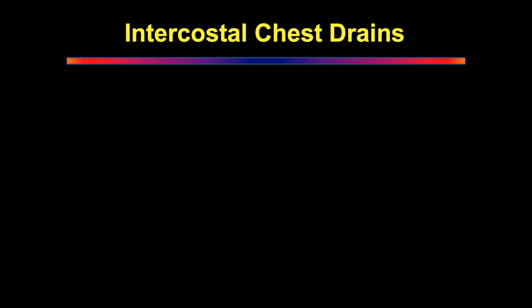What else? What other types of chest drains do you know of? Malecots and the standard. Okay, what else? Pigtail. Yeah. What else? Indwelling pleural catheter. Thank you very much. Okay, so don't forget indwelling pleural catheters.